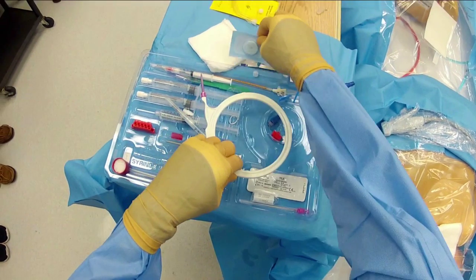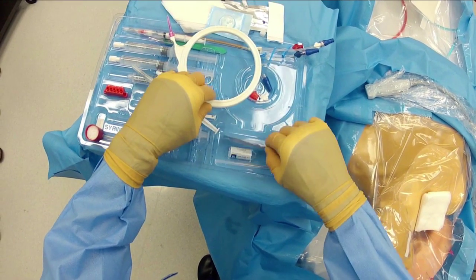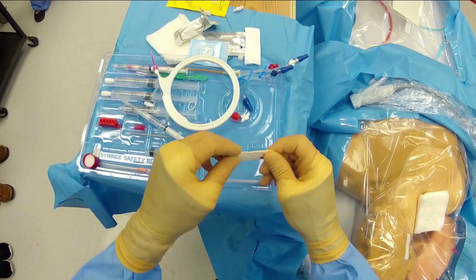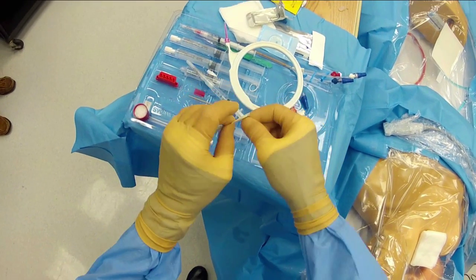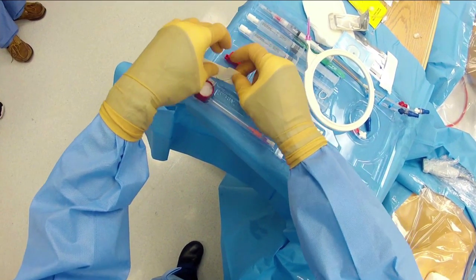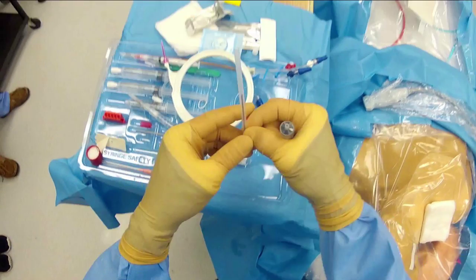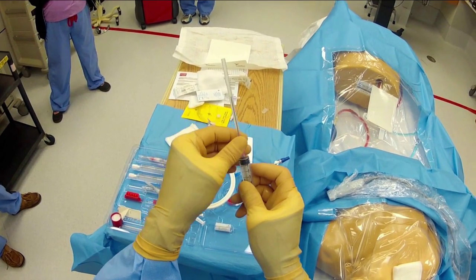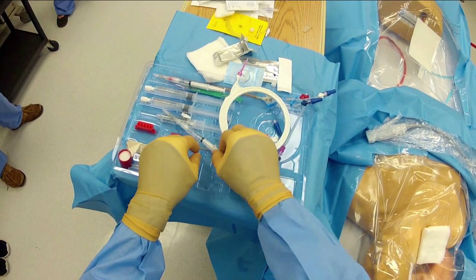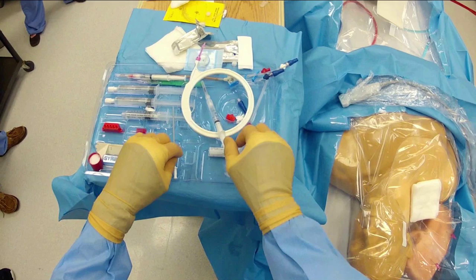We make sure all parts we need are in areas we can easily reach, removing extraneous items. We prepare the suture by opening it with the needle out for easy access, but place it within the styrofoam needle holder so no sharps are exposed, with the suture still within its cover on the side. We place the introducer needle onto the syringe making sure the bevel is aligned with the numbers, and ensure all pieces we'll need are in order and easily accessible.